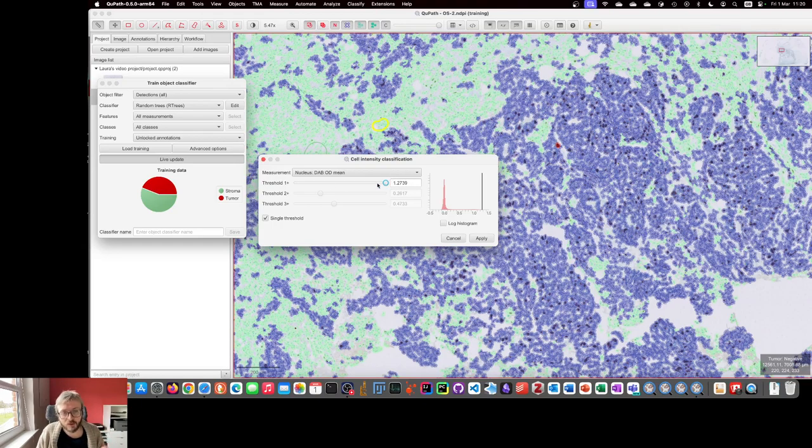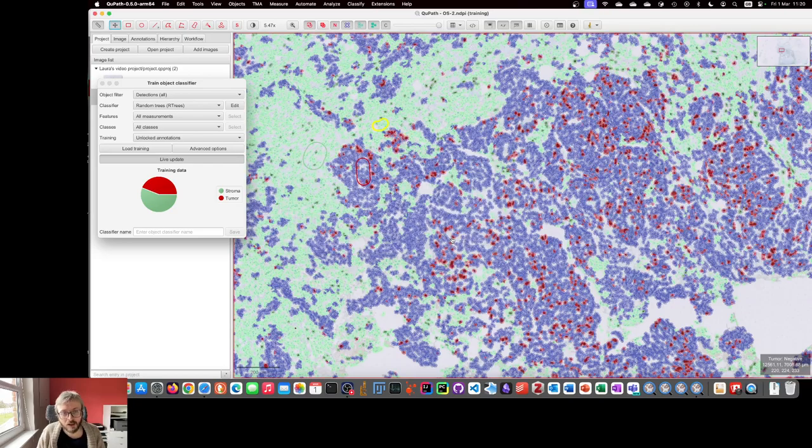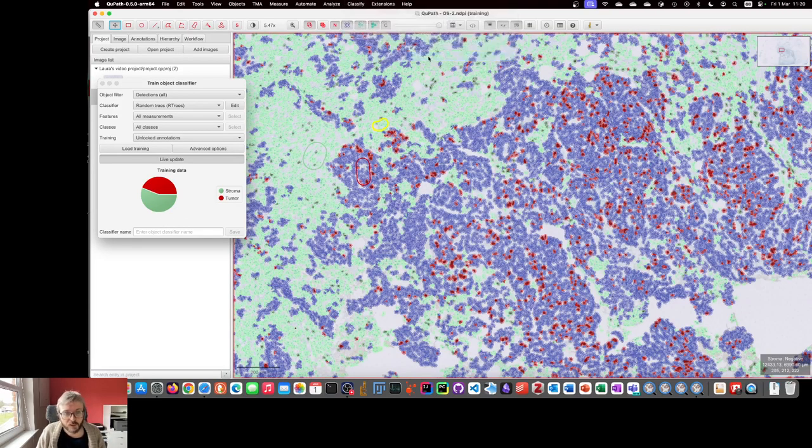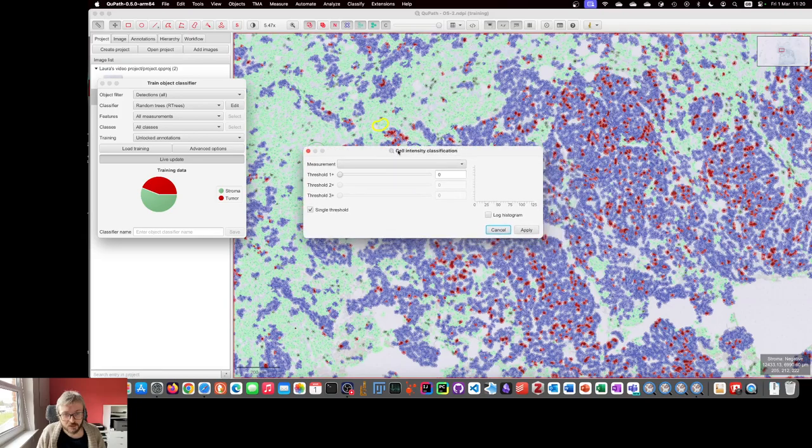And that means that we can make our changes in here and we can press cancel and we don't have to apply them because we have that clear separation.